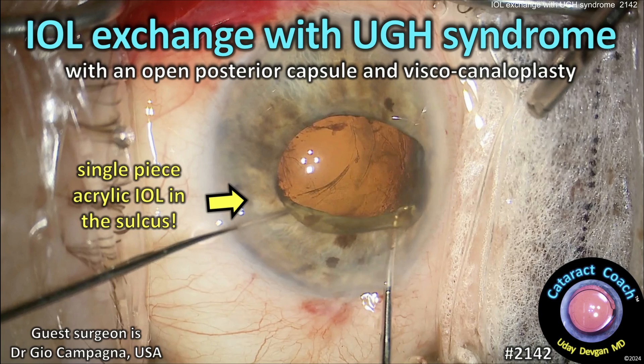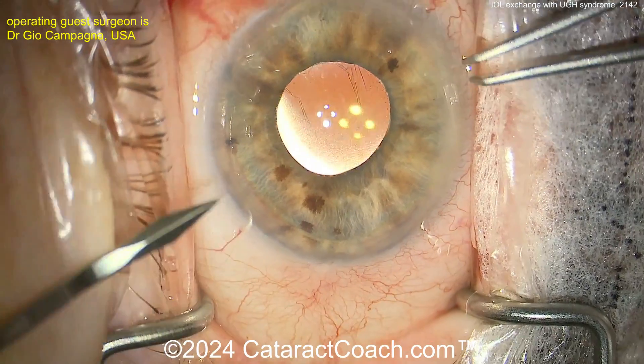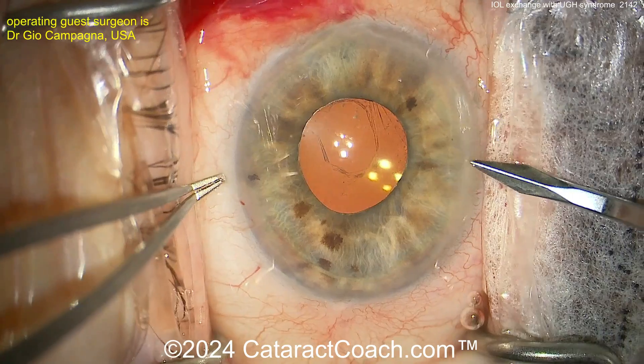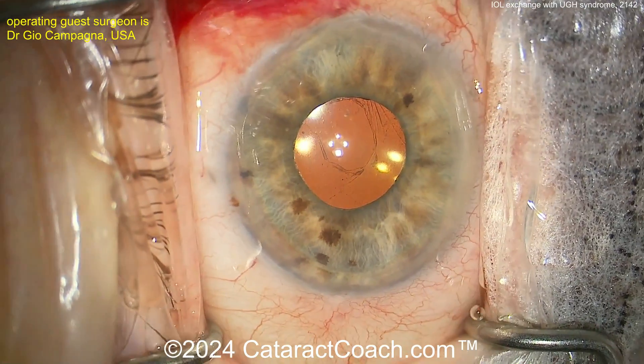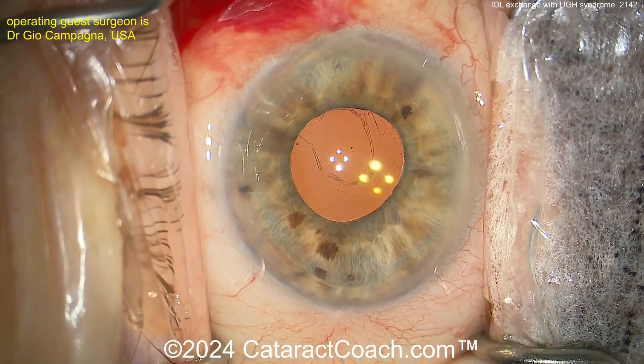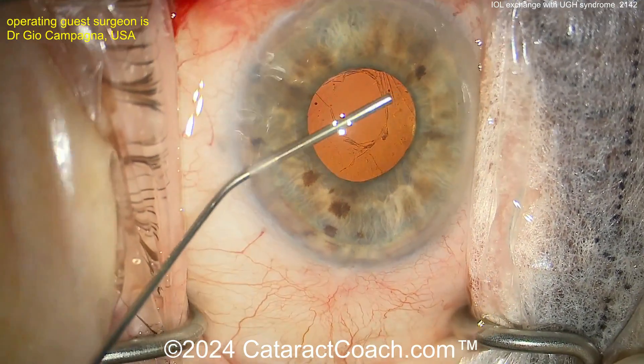cataractcoach.com. IOL exchange with UGH syndrome and an open posterior capsule with viscocanaloplasty. Remember, never place a single-piece IOL made of acrylic in the sulcus. You don't want to do that. The haptics are too thick. And what ends up happening is UGH syndrome — uveitis, glaucoma, hyphema.